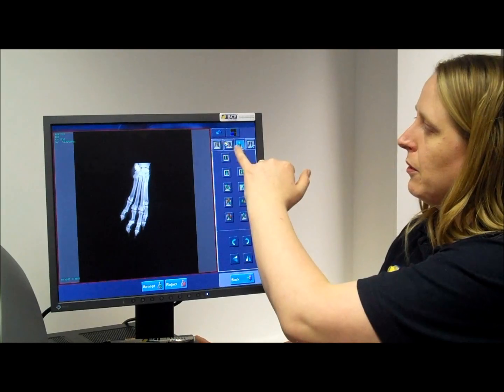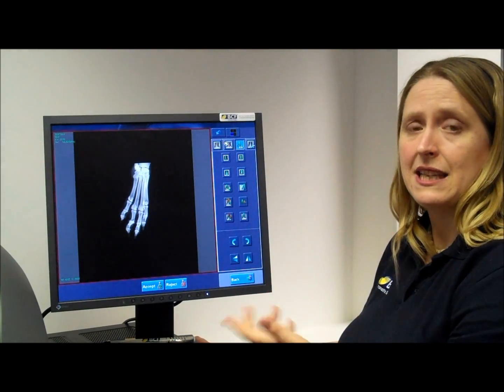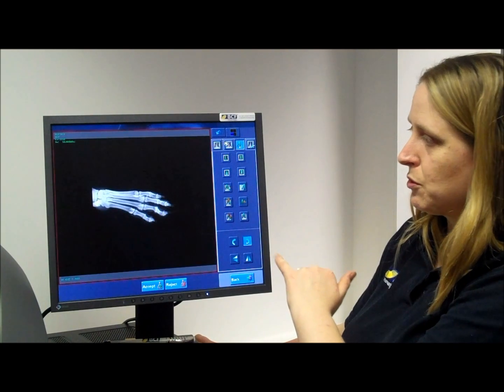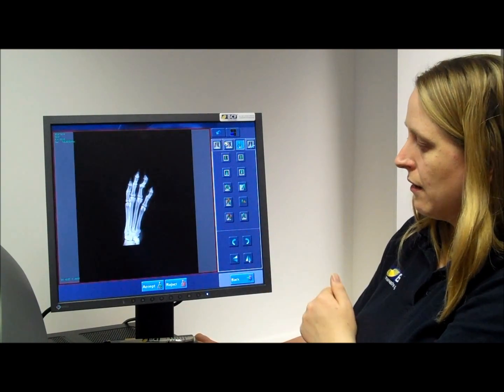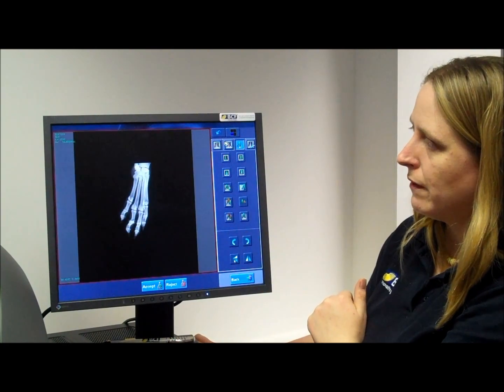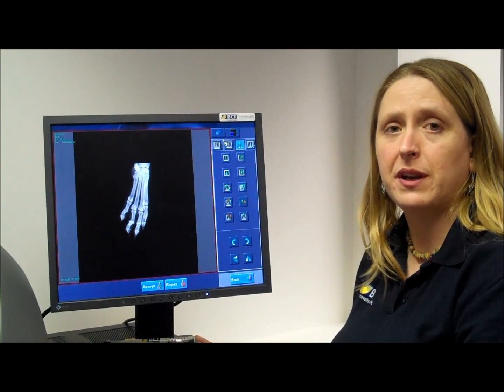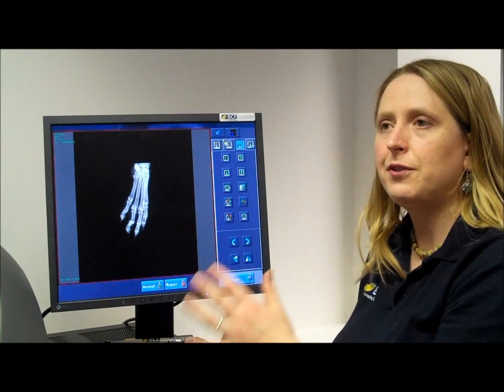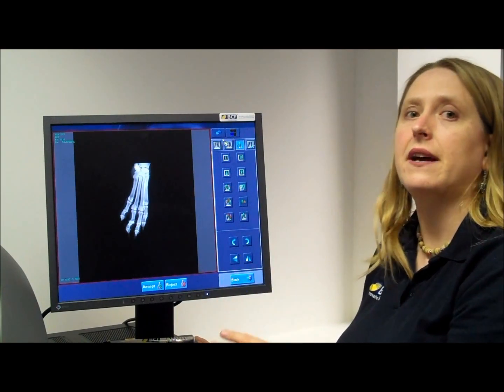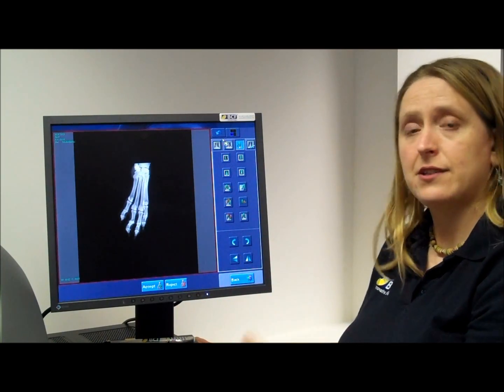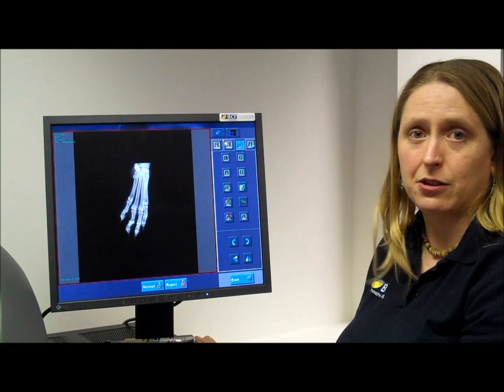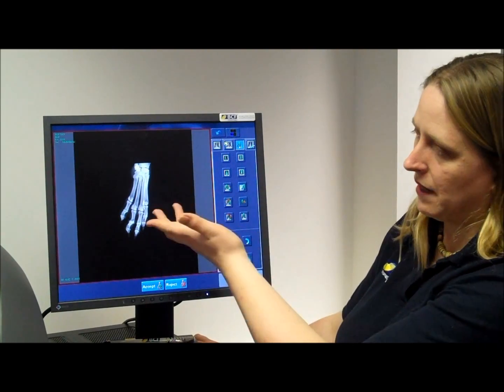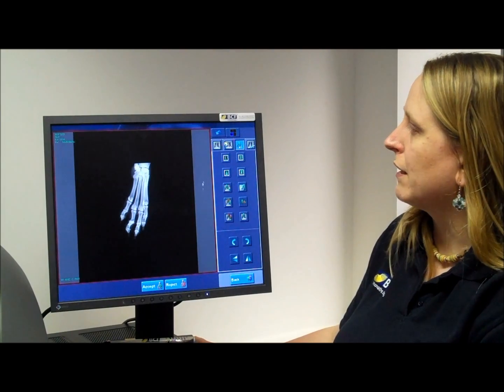The next tab along is your annotation, rotating and flipping button. So you can rotate the picture around if it was the wrong way, or flip the picture if you need to mirror it. The best way to view an image is always with the dog walking off the left-hand side of the screen, and if you always rotate your pictures to that orientation, the next time you go to view them they're automatically the right way up, which looks a lot nicer. And as you can see, the foot is correctly orientated.